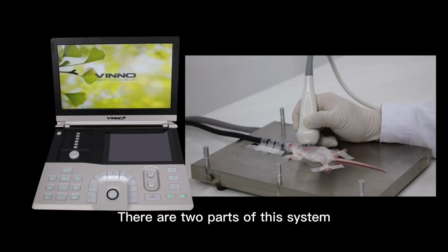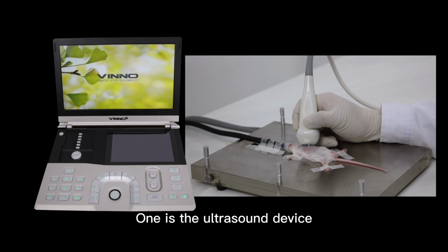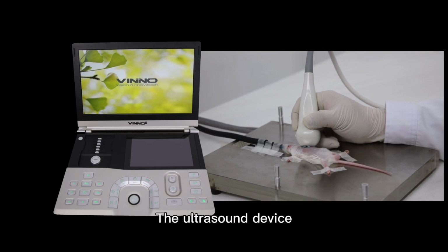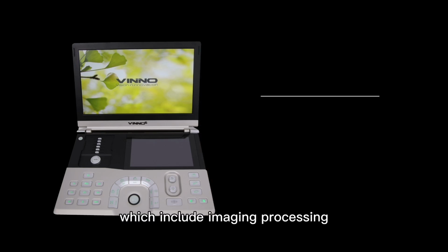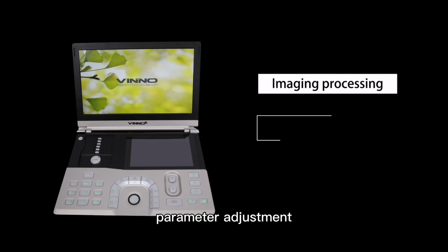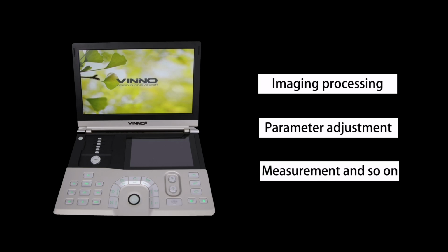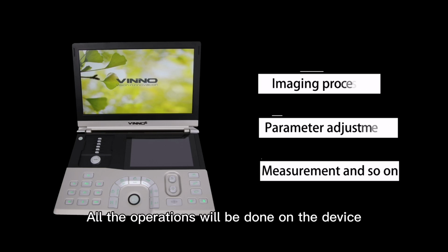There are two parts of this system. One is the ultrasound device. The other is the probes. The ultrasound device includes image processing, parameter adjustment, measurement, and so on. All the operations will be done on the device.